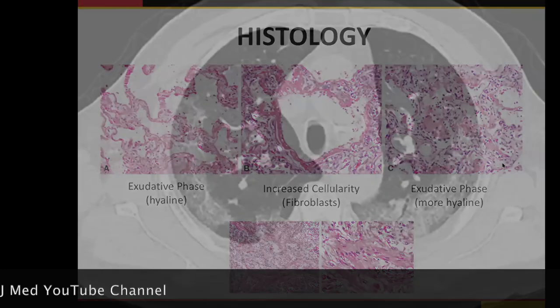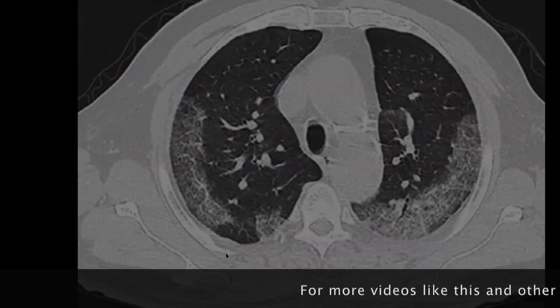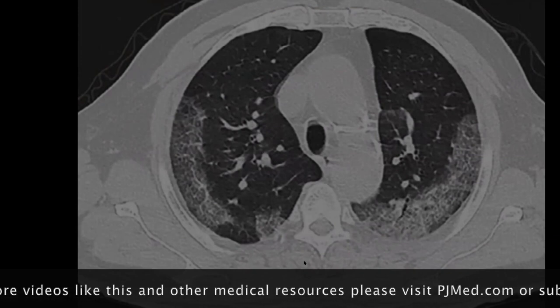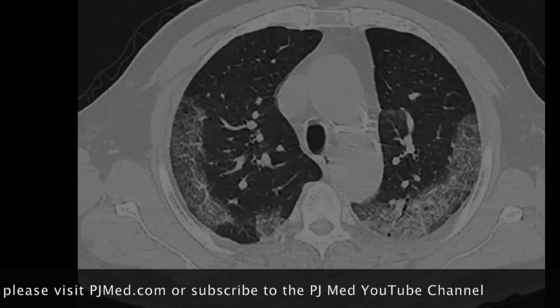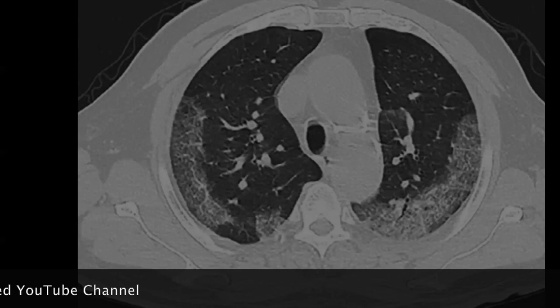Here's some CTs from COVID patients. What we're seeing is, so this is a cross-section. I won't get into CT anatomy. We can do that some other time, you've got the expert at it, right? You're talking to your medical director here, okay? But what we're seeing are some of these basilar, so the base, think of the low parts of your lung and the back part of your lung. These patients are laying in bed.